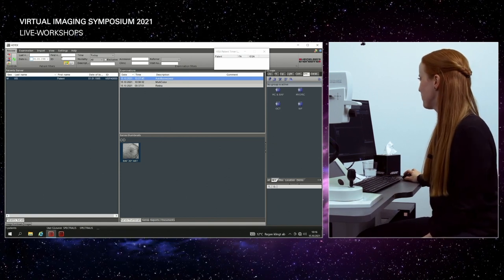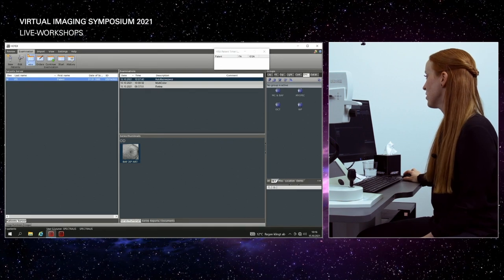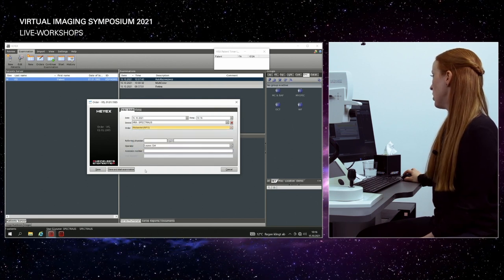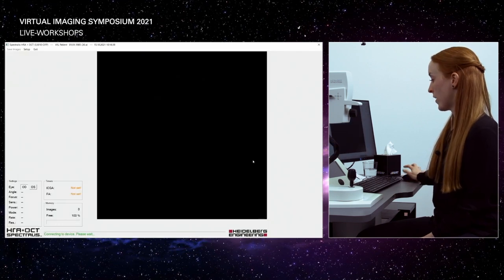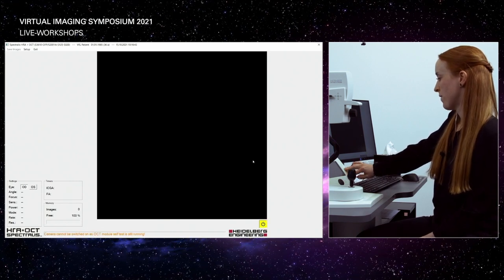Okay, so let's have a new examination for our patient. And we will do a 55 degree wide field image. Okay.